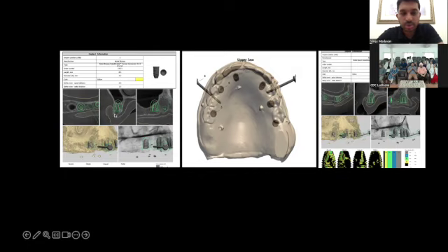Now, although the bone is up here, if I did not have a tooth setup, I would probably end up placing my implant very shallow. That would leave very little acrylic. Like, you see what I'm saying? So we want to make sure that you have enough of this acrylic height, especially if you're doing an overdenture. You have to have a locator, right? The height of the locator and the height of the housing and acrylic or the pink part, and then the teeth. So you need to have adequate space in this area.